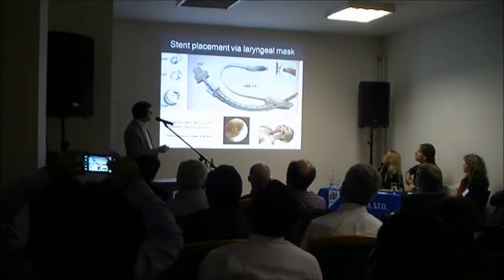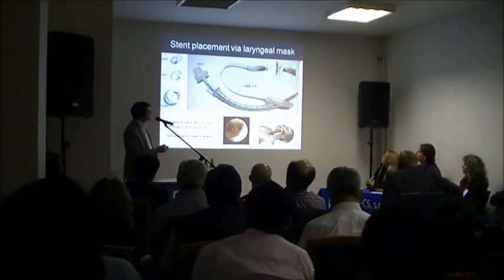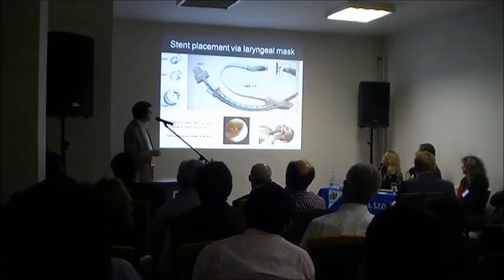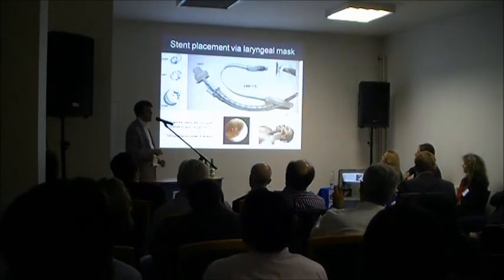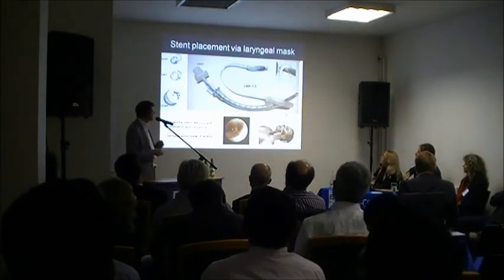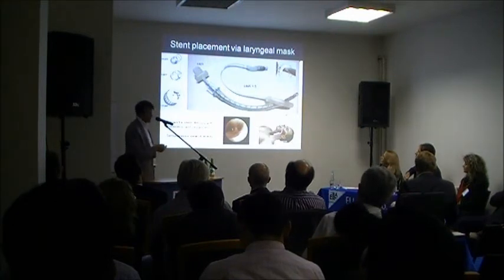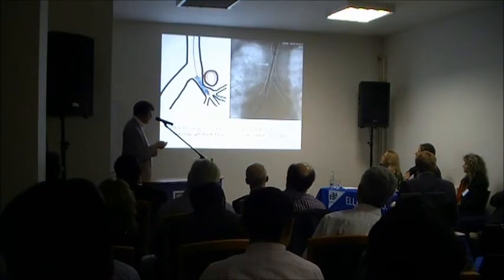This is the same 3mm diameter stent delivery device with the room around the laryngeal mask. Lots of room. In fact, we can put a bronchoscope through there. Here is a bronchoscope simultaneously through, and there's the gold tip. So we can align the stents not only radiographically, but we can visually see where the perfect position of the stent is, so we can deliver it perfectly. And this has worked very well. So the laryngeal mask is now one of the favorite ways that we use to put these stents in.